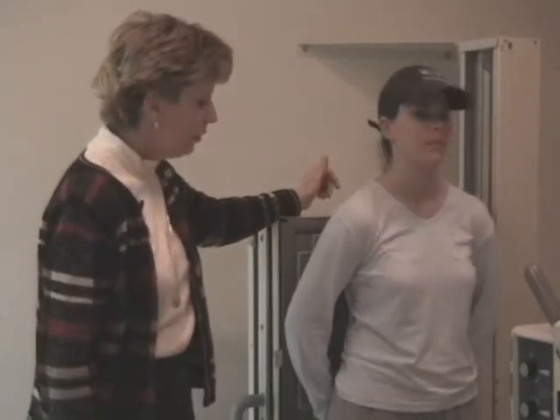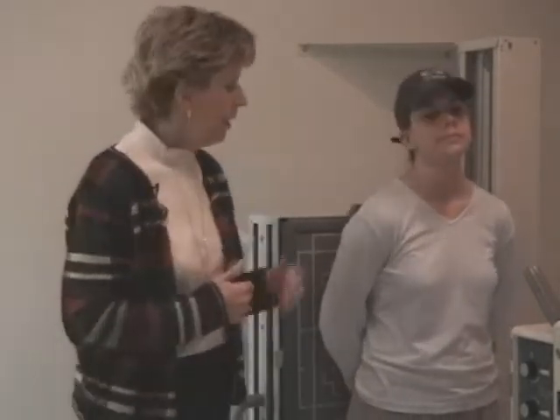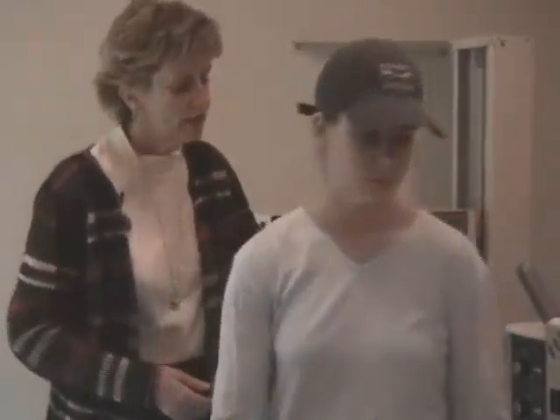If the patient is not rotated, you will have the wings of the ilium equal in width on the two sides. If there's rotation, the side that's closest to the film will actually be wider than the side that's away. Okay? After our upright abdomen, we are going to want our patient to lie down on the table. So we're going to readjust things here.